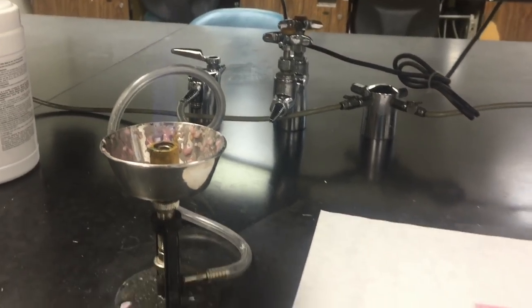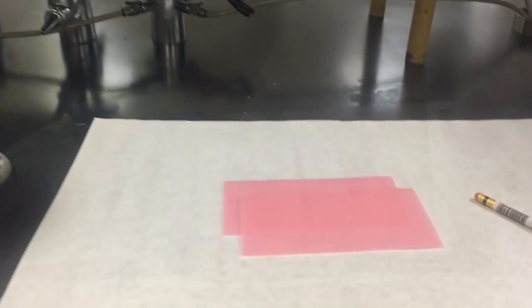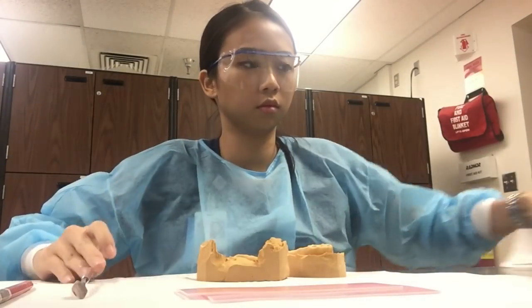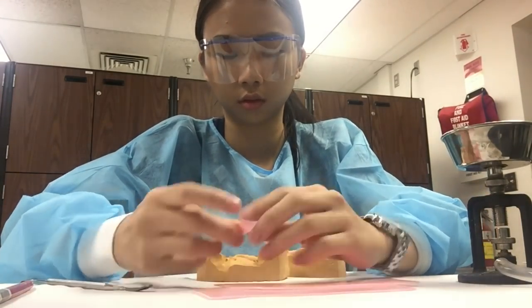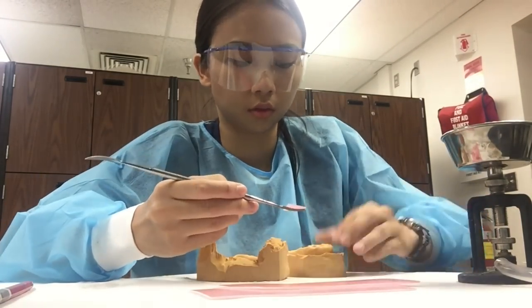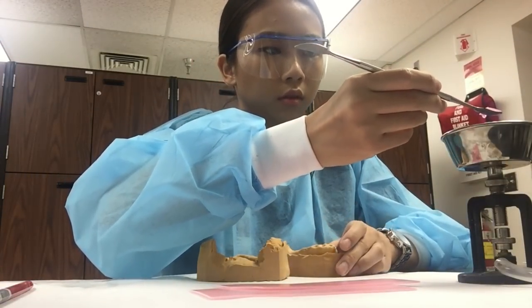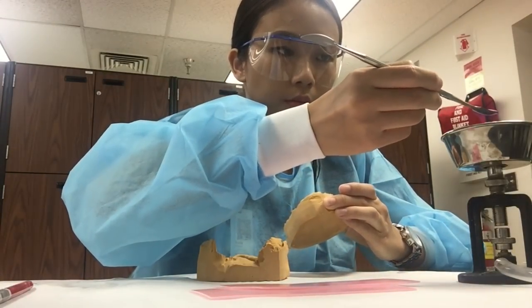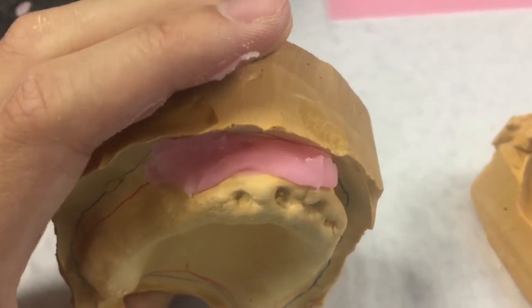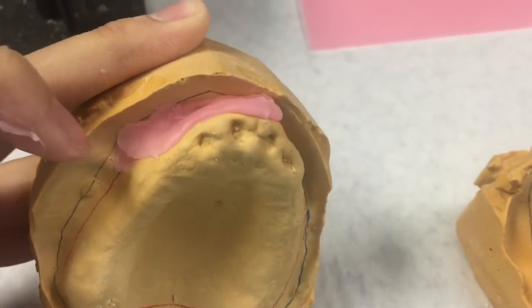Next we're going to block out the undercuts using wax. The reason we block out the undercuts is that if we put the triad material on and there are undercuts, we can't remove it from the stone — and that has happened and it took a really long time to get it out. So I'm using Vaseline and melting some pink wax to block out the undercuts.